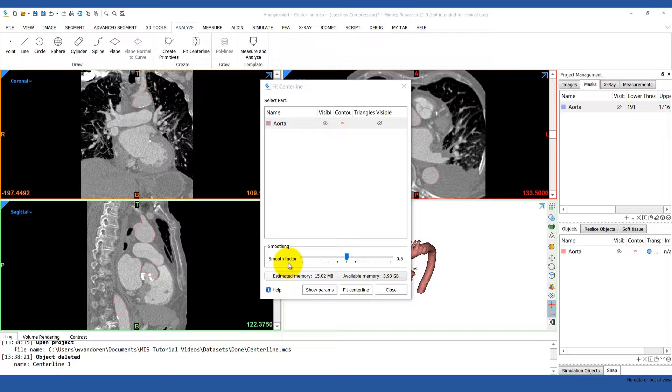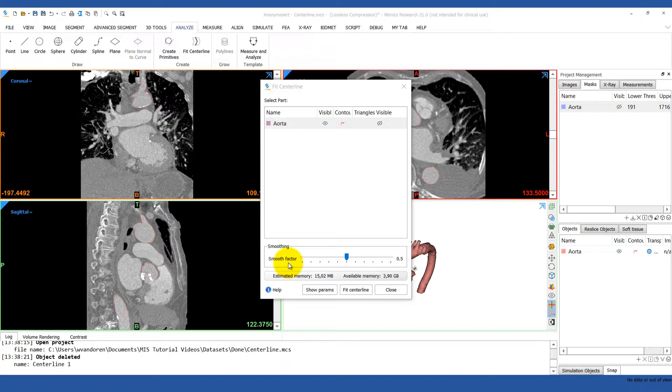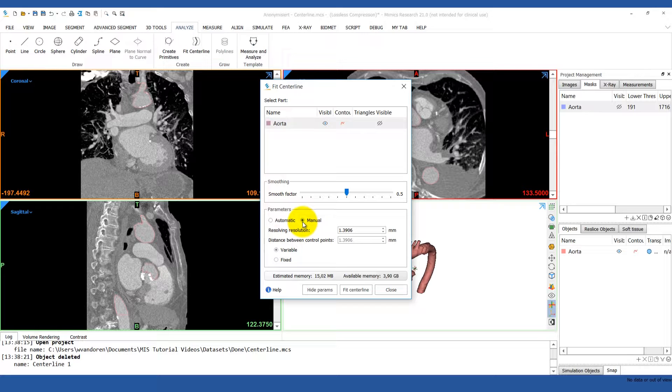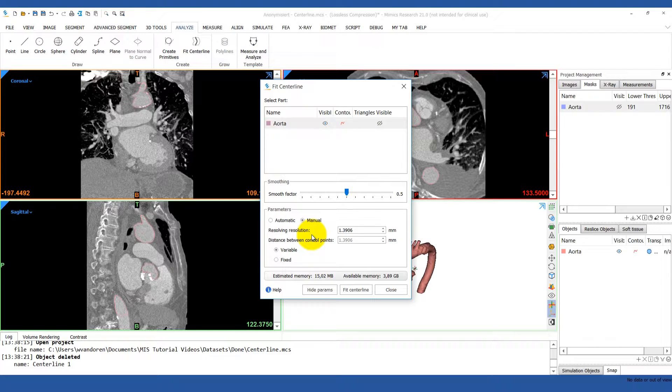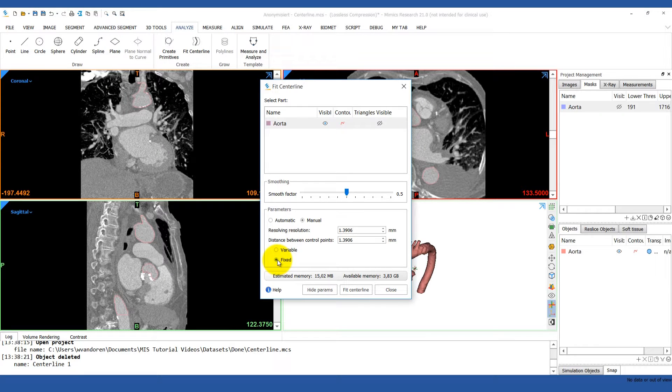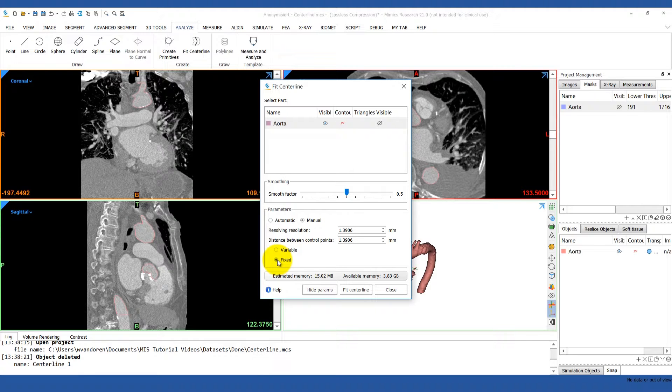There are also two advanced parameters that you can adjust by hitting the Show Parameters button. Resolving resolution indicates the size of the tubular structure that can be recognized by the algorithm. So a smaller resolution results in a smaller diameter of the structure. By default, this parameter is automatically set to two times the pixel spacing of your images. You'll find that works just fine most of the time. Distance between control points sets the distance between two adjacent control points, between which the centerline will be interpolated. Again, this is set automatically but you can manually change it to a fixed distance if desired.